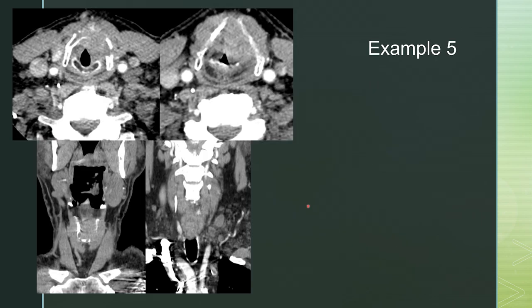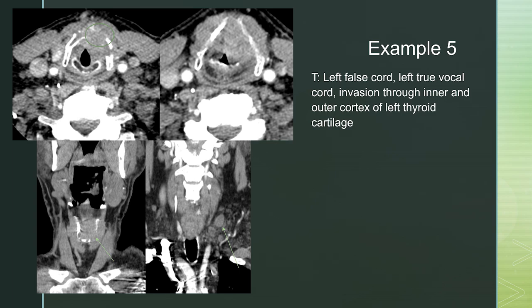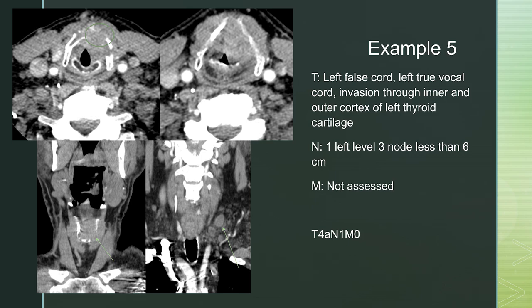Last but not least, we have another large lesion — a bulky mass extending across the anterior commissure with destruction of the thyroid cartilage, seen through and through on both sides. On the coronal view, there is a glottic and supraglottic lesion with erosion of the thyroid cartilage. There is an abnormal left level 3 lymph node with stranding around it, worrying for extracapsular extension — to be confirmed on pathologic diagnosis. This involves the left false cord, left true cord, and invades through the inner and outer cortex of the left thyroid cartilage. One left level 3 lymph node less than 6 centimeters. Distant mets not assessed on this CT. This stages as T4A, N1, M0.